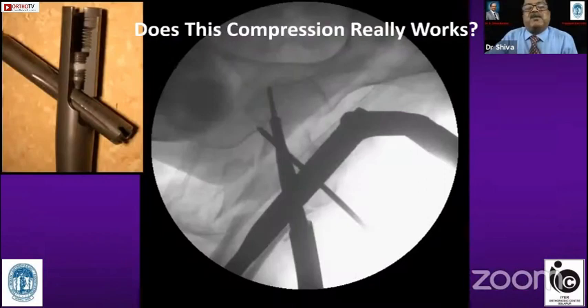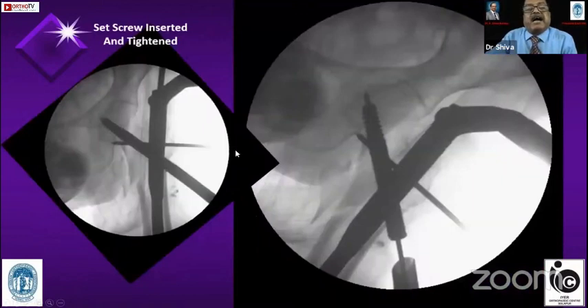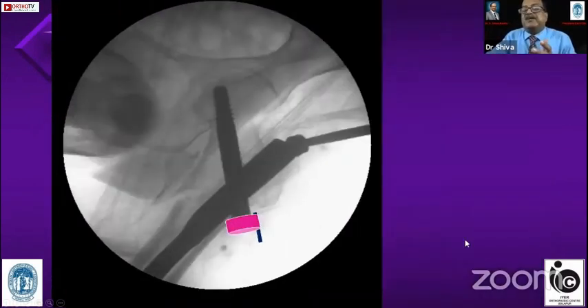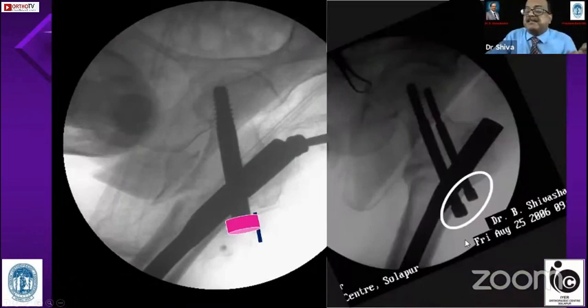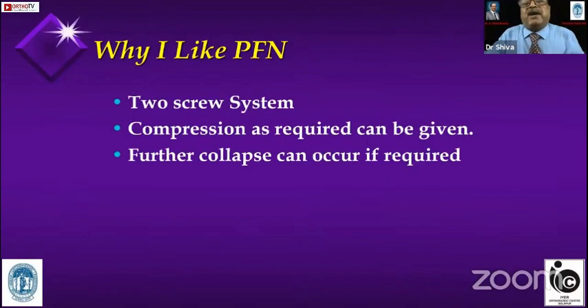In my own ZNN case, I compressed the fracture by pushing the sleeve, achieving about one centimeter of compression. But as soon as I removed the jig, the compression had already decreased — you can see how much screw is outside, but the compression is less because the lateral wall has no support at all. If there was a head to this screw, that problem could have been solved. That is the reason why I advocate screws with a head — and none of the newer screws have one. That is the problem I face.